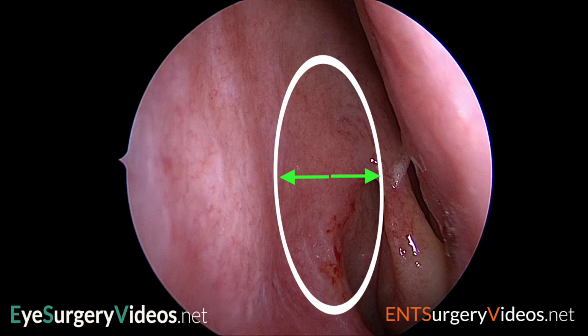Similarly, the anteroposterior position of the sac is variable, but once the sac has been partially exposed, the bony ostium location can be suitably positioned and sized.